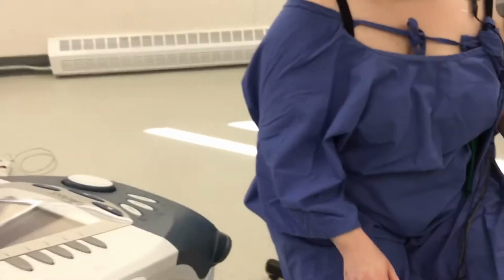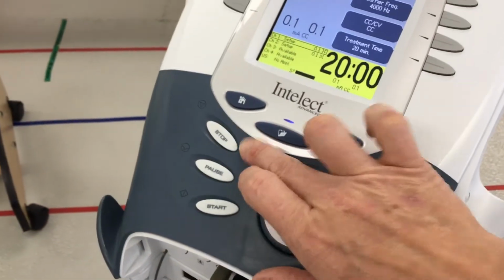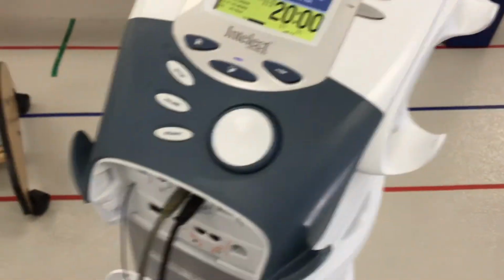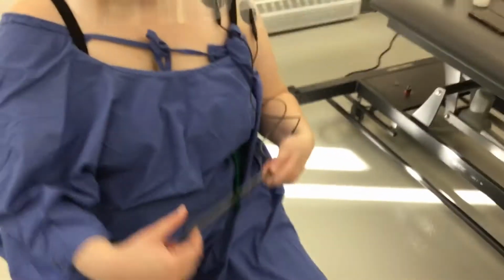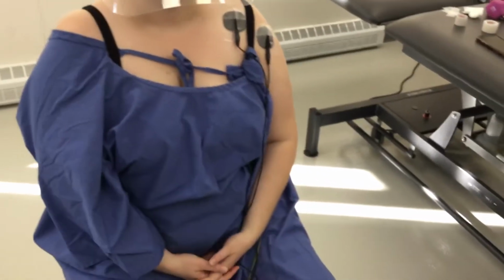We're going to put the machine where she can adjust the intensity by turning it up or down. We'll show her how to do that. She can pause it, or she can stop it if she needs to. If she is going to be up and moving around, what we can do is secure the lead wires. We'll use some tape so it's not going to be in her way, and we may even put them around over her neck and around the back.